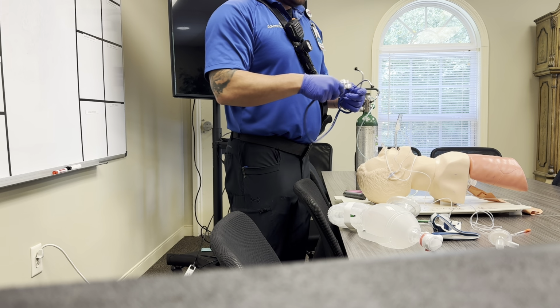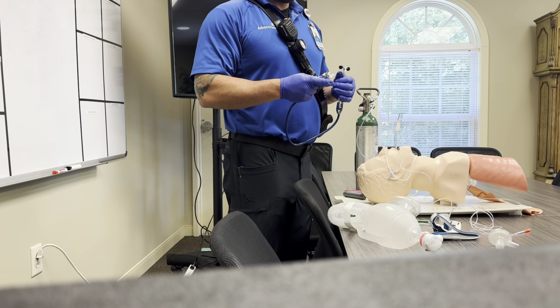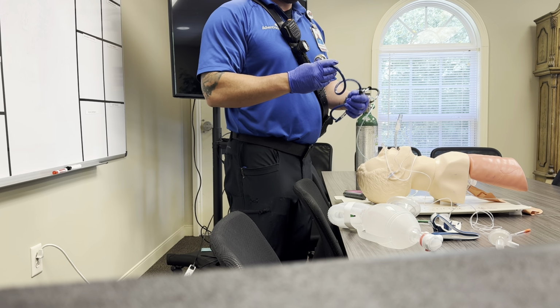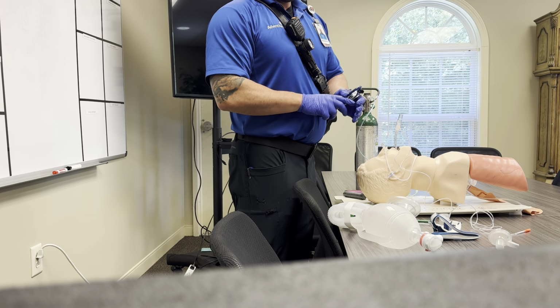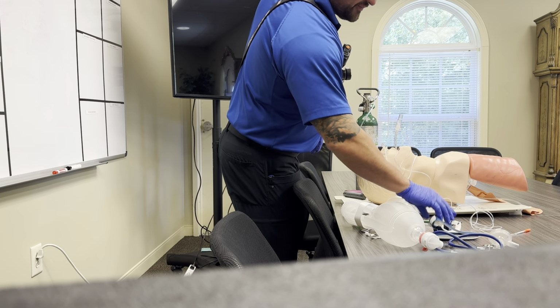I like to auscultate the areas of the abdomen just to make sure I'm not hearing any adventitious, gastric sounds. Do I note any air rushing into the abdomen, anything like that, just to make sure that we're in the correct placement area for our tube.